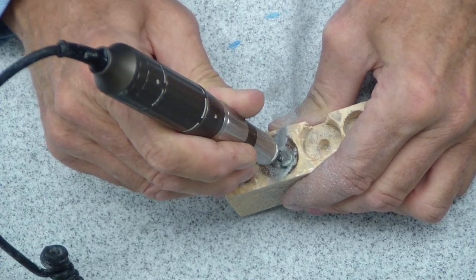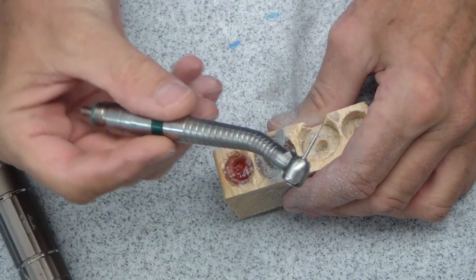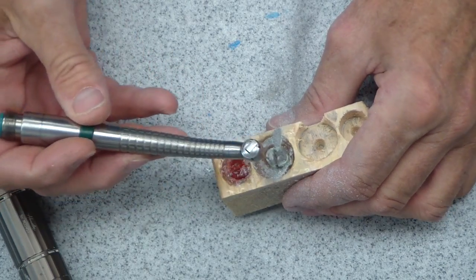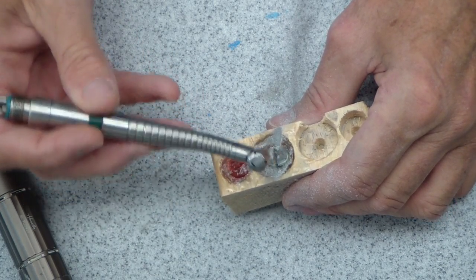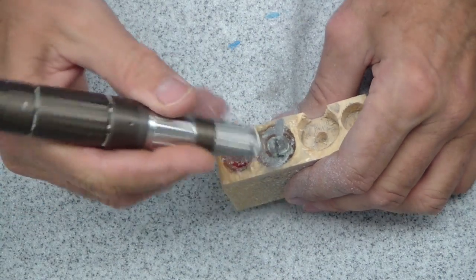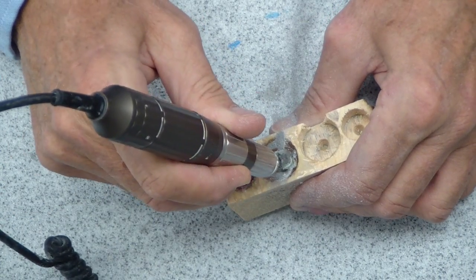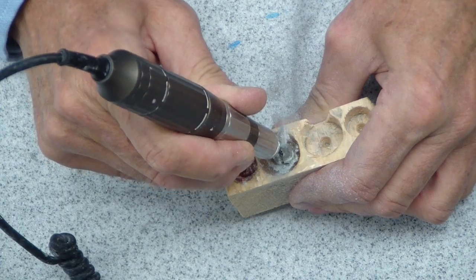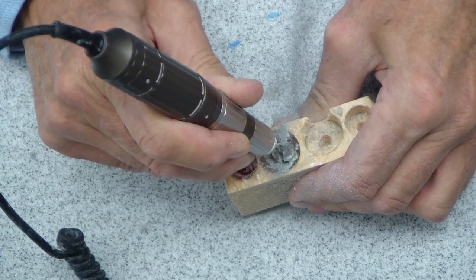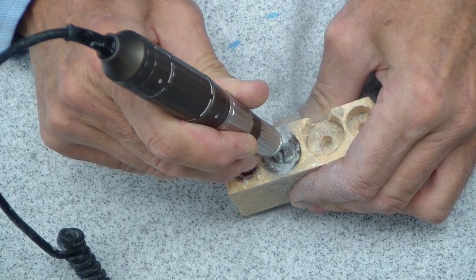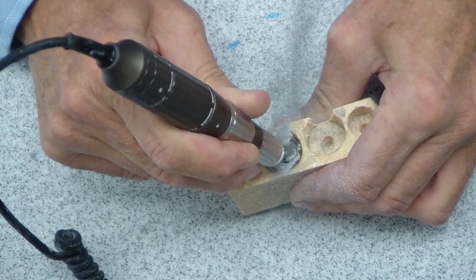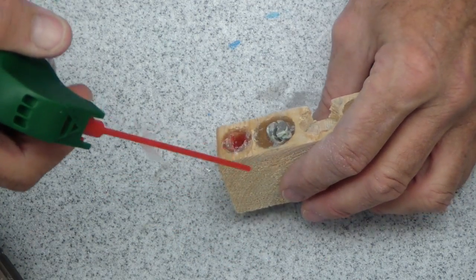If you want to do this with your typical contra angle, that's good. You can do this with a contra angle. In fact, that's what I like to use is the impact handpiece on these teeth. The surgical one, as you can see as I'm holding it, it's kind of awkward to get in there with the right angles.